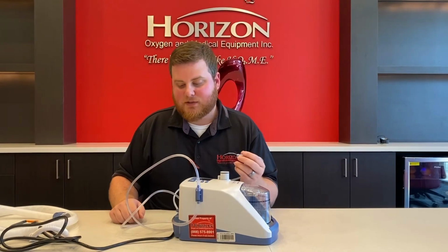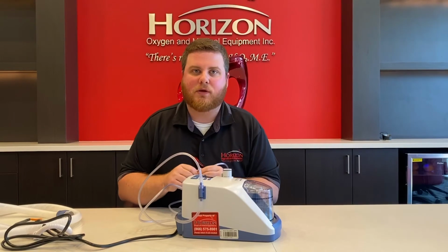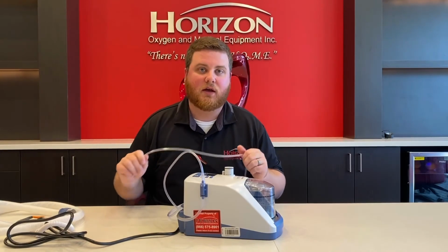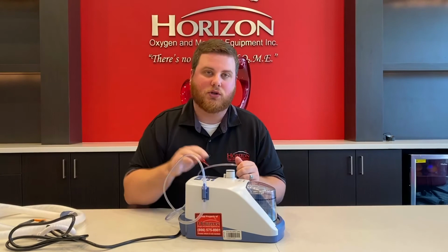So some people don't like having the concentrators in the room. We understand that, but we want to try and keep those items as close together as possible. So try to keep it 7 feet, but we can never go more than 25 feet of oxygen tubing between the concentrator or oxygen source to the machine.